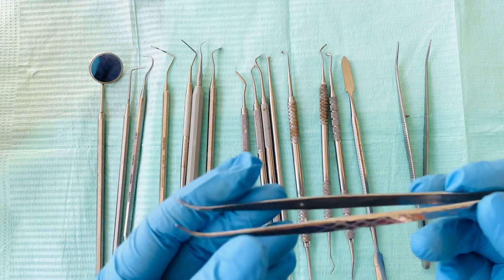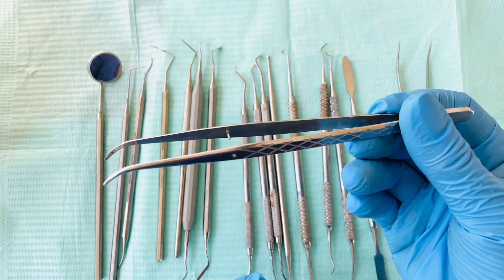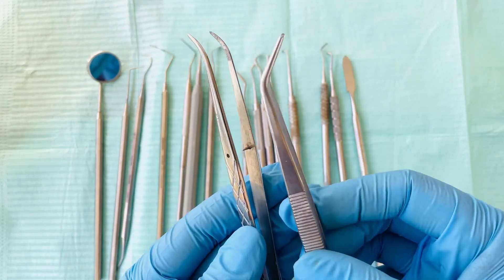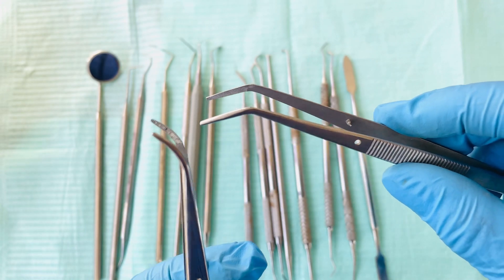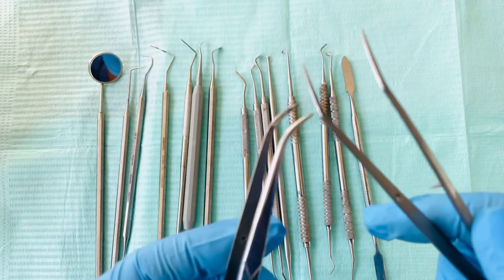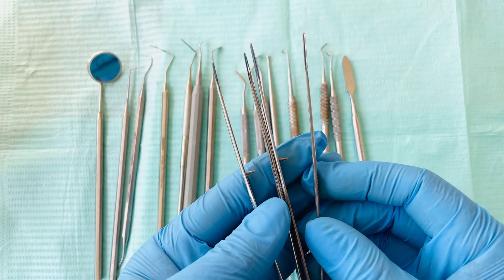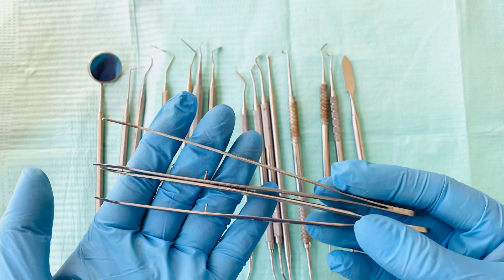Now we have the college tweezers — in some countries they call it a cotton plier. It comes in different styles: this one has a longer end, this one has a curved end, and this one is slightly angled. That's your college tweezers, or cotton plier.